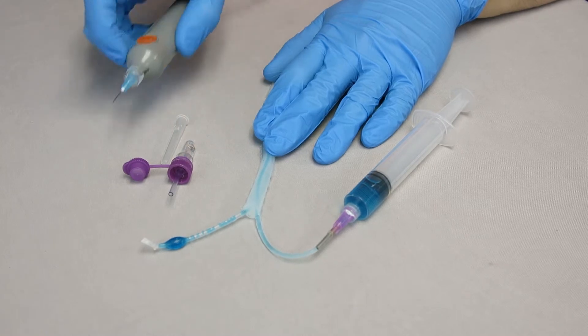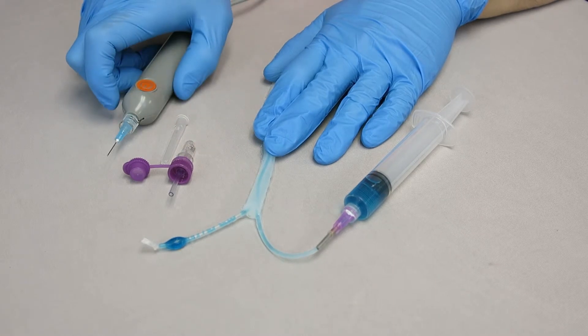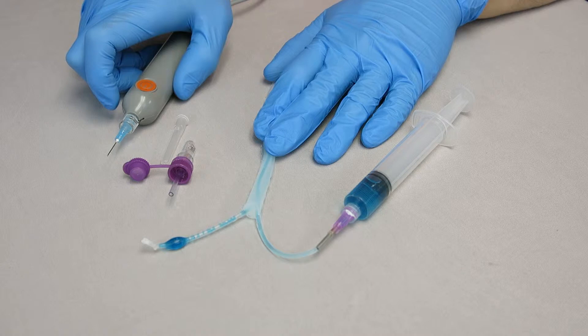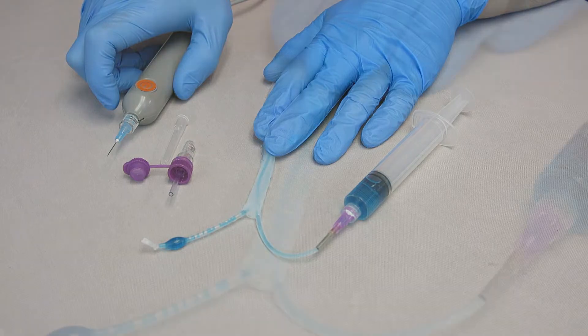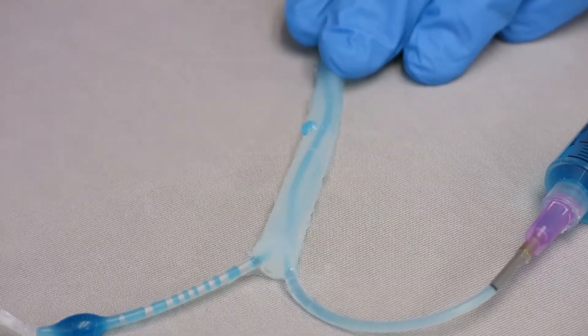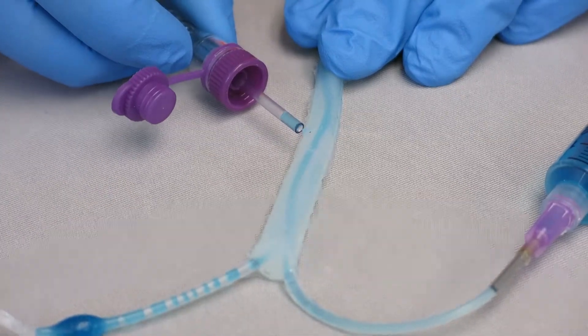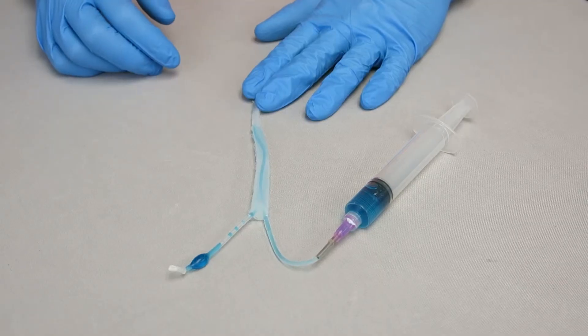After puncturing the vessel, press the start-stop button on the handpiece again to stop GentleSharp. Set handpiece on a level surface while making sure that the tip of the sharp is facing away from the area of blood collection and the operator. Collect your blood sample. If your blood sample is not enough, repeat the sampling procedure. At this point, place the rodent back into their housing area.